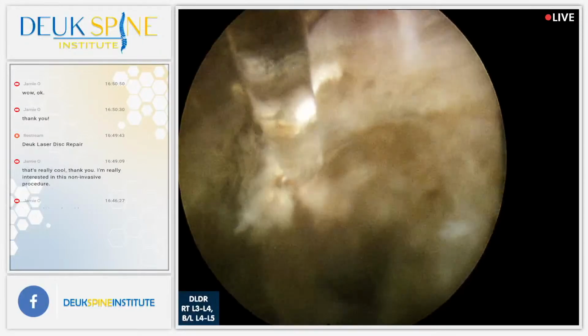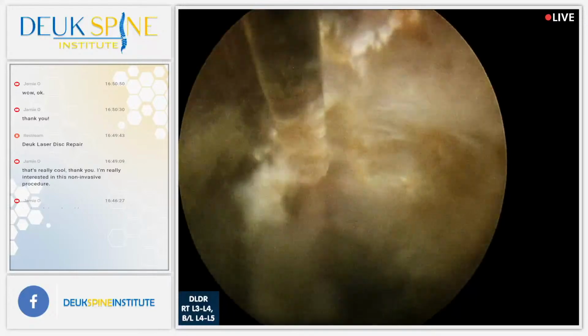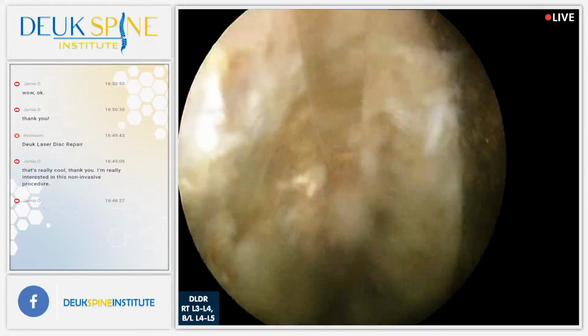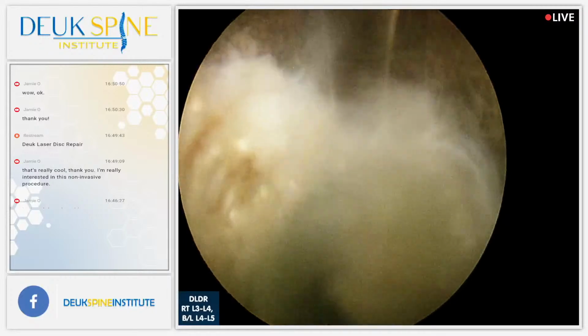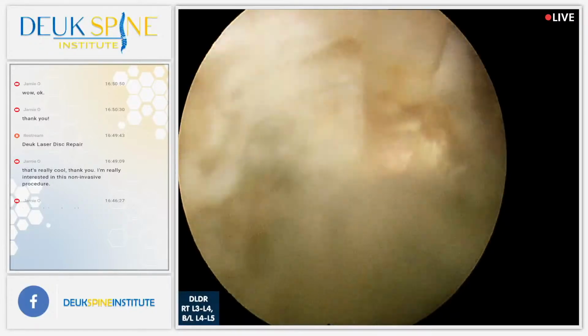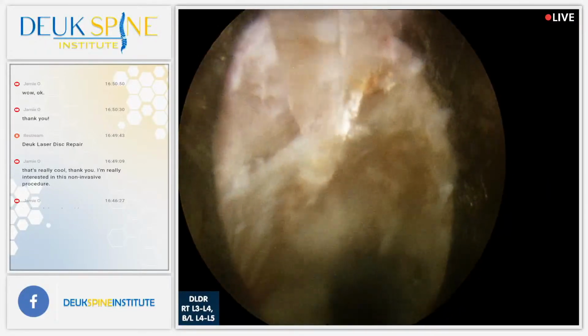What you're watching here, Jamie, is the most advanced spine surgery in the world. It's not available everywhere because most doctors don't know how to do this surgery. But if they knew how to do this surgery, they would be doing it just like we do here at Deuk Spine. We've evolved way beyond fusions and artificial discs and destructive surgeries like laminectomy.